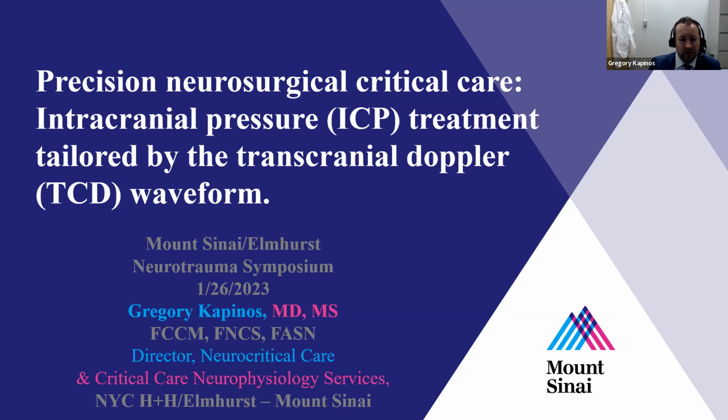What the TCD waveform, the Transcranial Doppler waveform, can tell us additionally, or actually before you have an intraparenchymal or an intraventricular device to tell you traditionally, conventionally, what is the intracranial pressure, how you can infer even more data than just the ICP by using Transcranial Doppler, whether you use it sporadically as a one-spot imaging technology, or even better, when you run it continuously as a continuous TCD monitoring device.